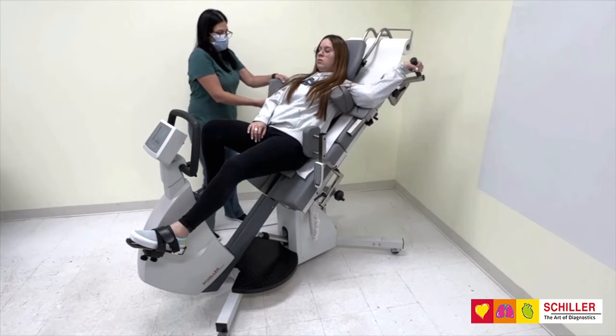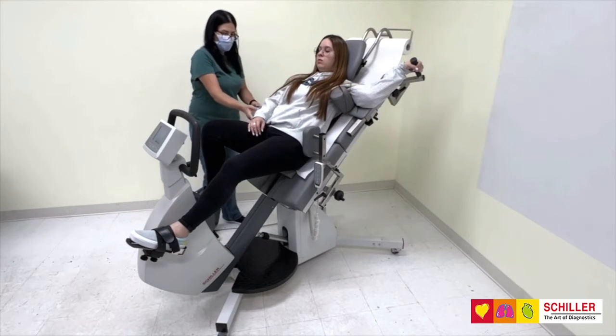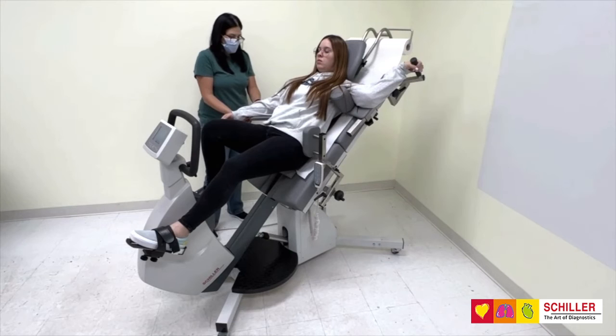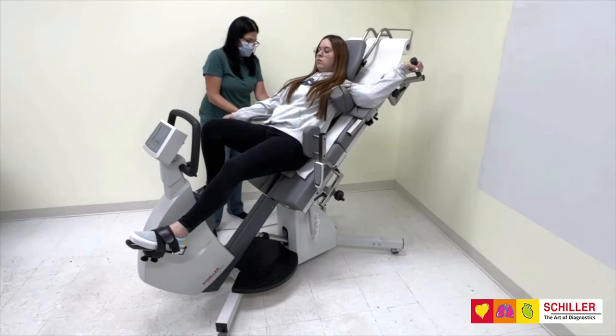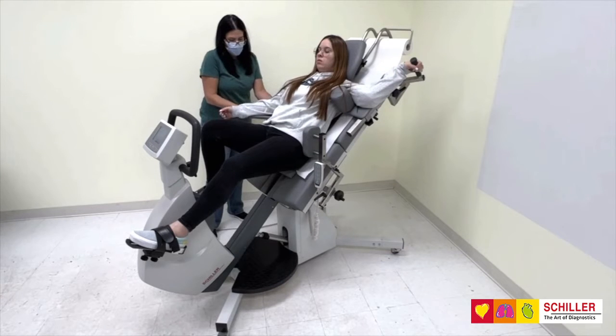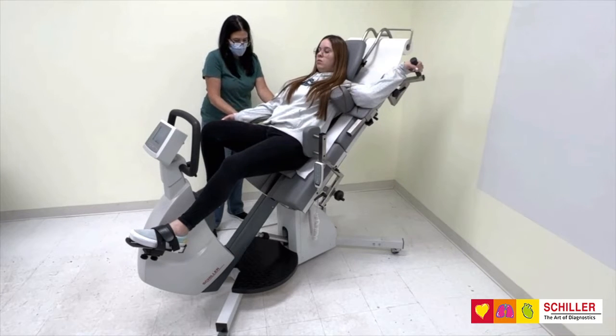The right arm rest is retractable and provides arm support while measuring blood pressure and for patients with intravenous catheters. The height of the right arm rest is adjusted manually.